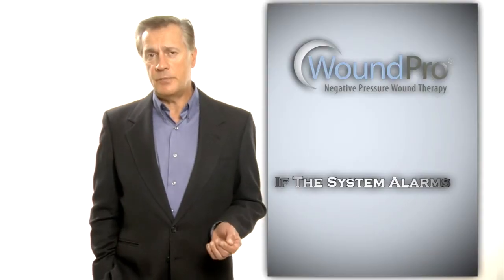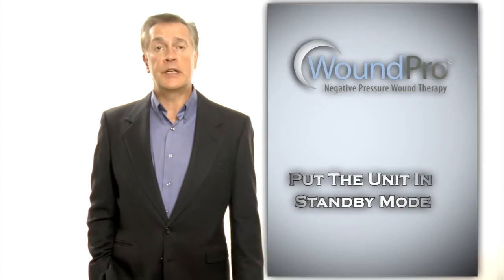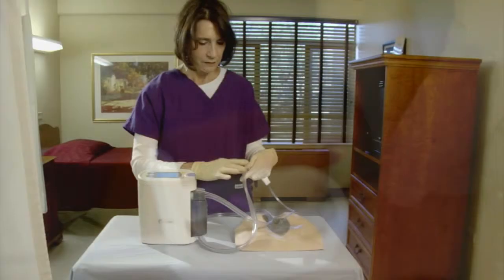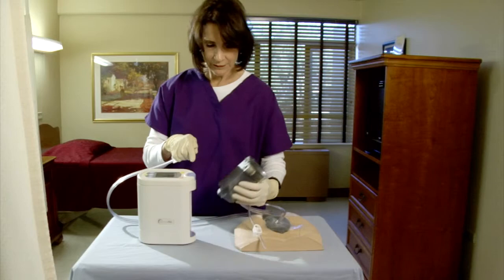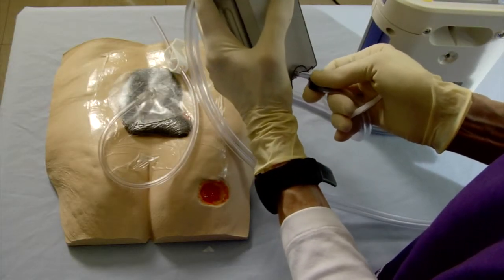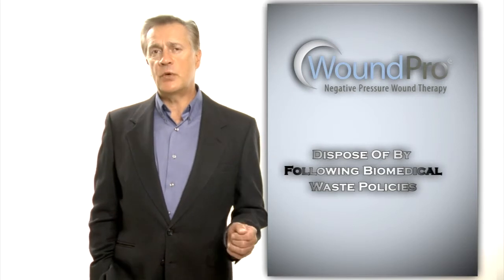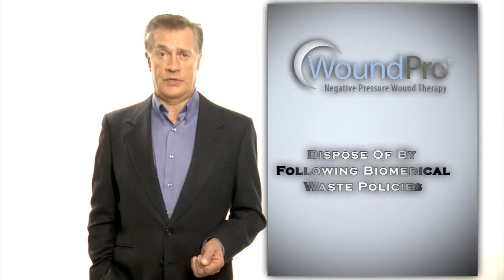If the system alarms and on the display it shows canister full, put the unit into standby mode. Place the white lumen tube lock on the tube closest to the dressing. Place the clamp around the dressing drain. Remove the canister. Place the Christmas tree end in the canister stopper and break this piece to block the end of the double lumen tubing. Make sure to dispose of the canister properly following your facility's biomedical waste procedures.